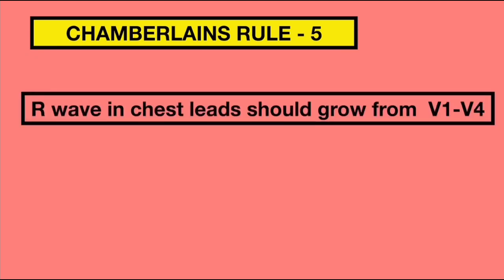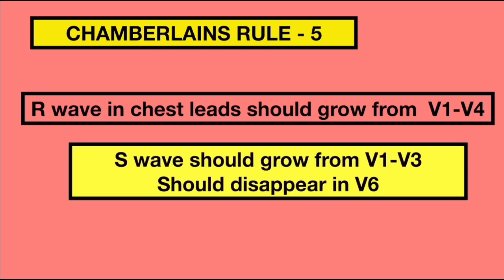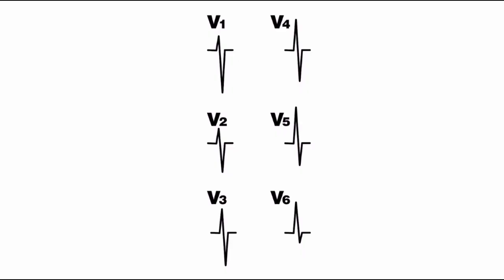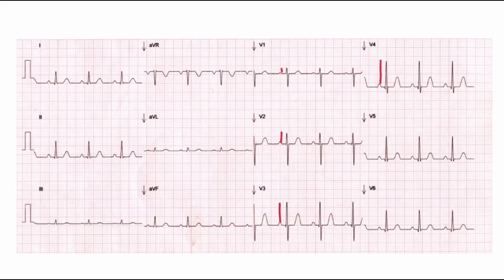Rule 5 states that the R wave in chest leads should increase from V1 to V4, and the S wave should increase from V1 to V3 and should disappear in V6. Here we can see the progressive increase in R and S waves. This is the progression of R wave from V1 to V4. You can also see that the S wave increases from V1 to V2, but in lead V6 it has disappeared.